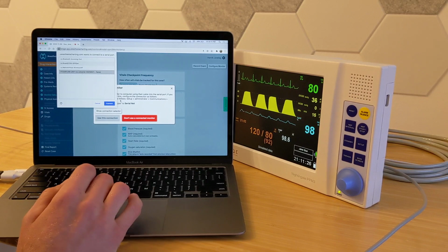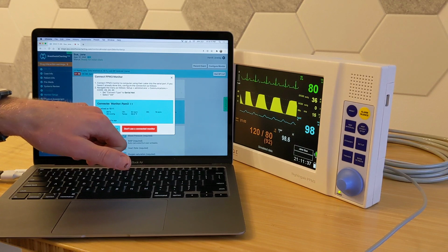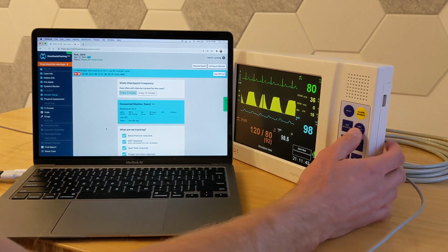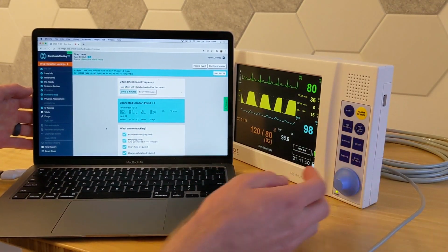So I'm going to select that, hit connect, and now it should be trying to get data here. So as soon as we get data from the monitor, it's going to show up in here. So now we have it. It says, last blood pressure was taken 8 minutes ago. That's why it's right up here in the background. But I'm going to say use this connection. I'm going to go ahead and just hit the start blood pressure here just so we get a new reading. But what I wanted to do, yes, I pushed it.